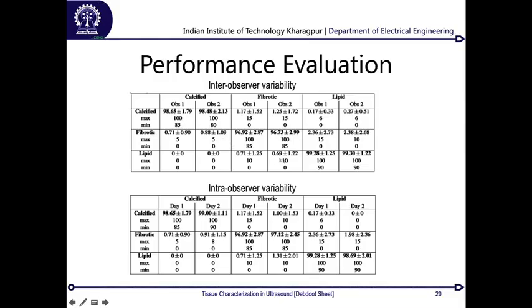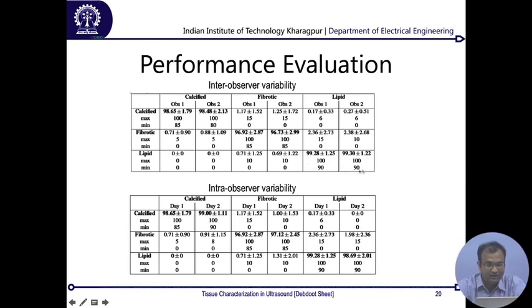So if you look over here, the diagonal line shows quite close to 100%, some of the highest values which you see, and the cross diagonal shows very low values. So this definitely signifies that the method is quite consistent as far as inter and intra observer variabilities are concerned, and you can read through the papers which are linked at the end for much more details.